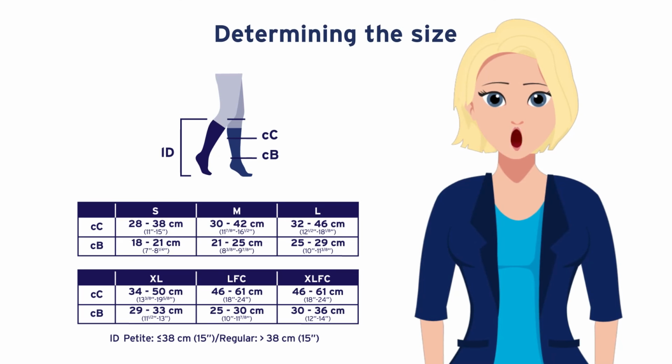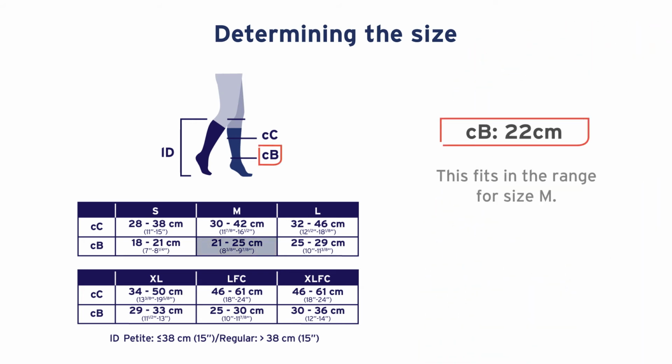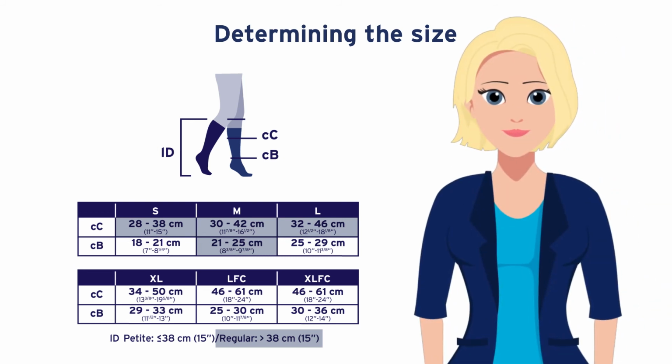Once the measurement is completed, please plot the measurements onto the sizing chart of the desired product and style to determine your size. Highlight the sizes on the chart that the measurements fit into. Once the sizes are plotted, choose the size that all measurements fit into. In this example, it is size M, regular leg.